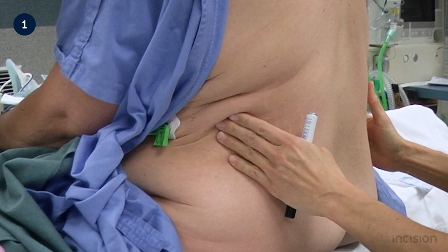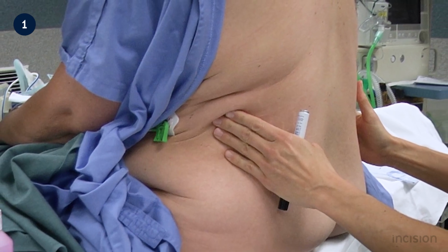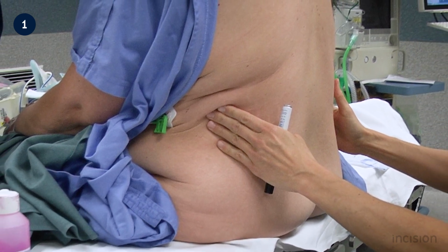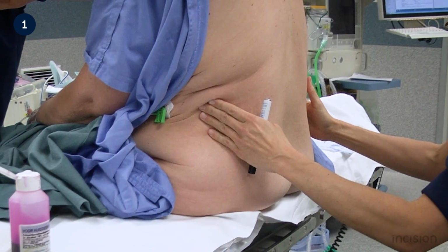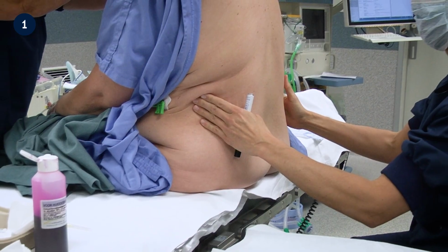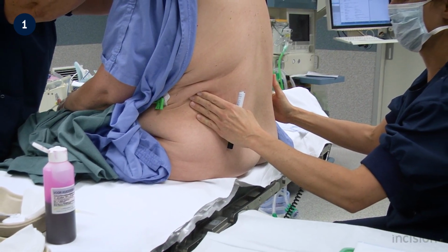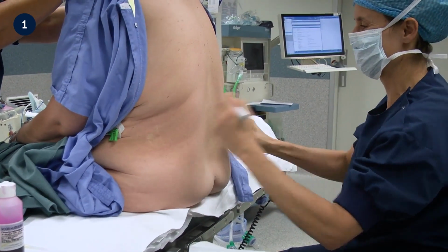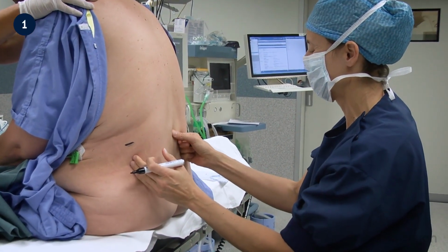In the right hands, spinal anesthesia, a neuraxial anesthesia technique, can be used to effectively provide anesthetic for lower abdominal and lower extremity surgery. In this film, relevant anatomic and physiological considerations will be discussed, as well as how to prepare equipment, medication, as well as a patient for the procedure. In broad terms, spinal anesthesia entails the introduction of local anesthetic into the cerebrospinal fluid.